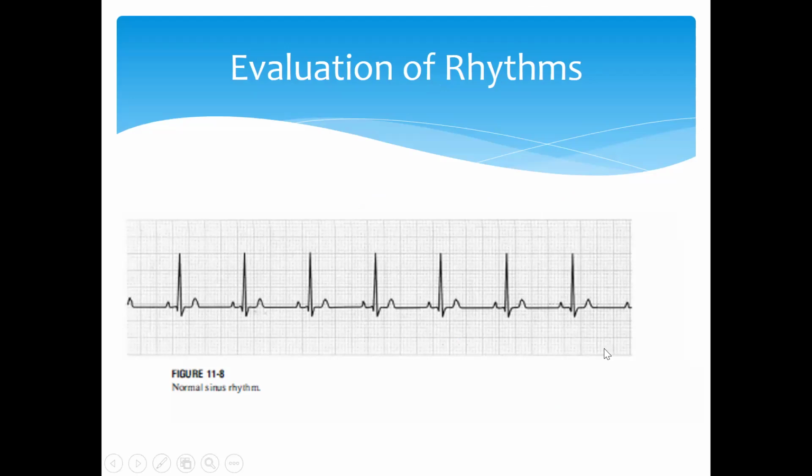This is 1, 2, 3, and 4, and if we count up to this one, they will equal 30 large boxes, because 5 large boxes equal 1 second. So how many boxes will be required to reach 6 seconds? Obviously 30. So 1 second equals 5 large boxes, and 6 seconds equals 30 large boxes.